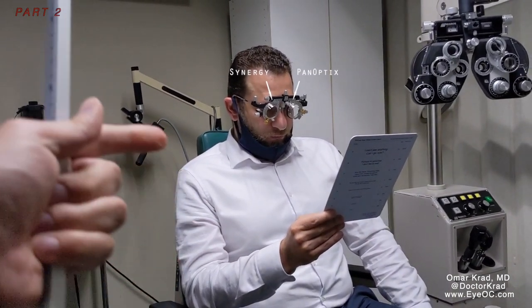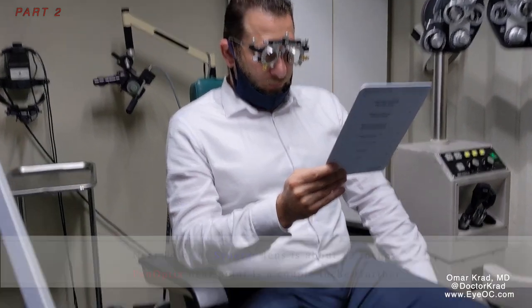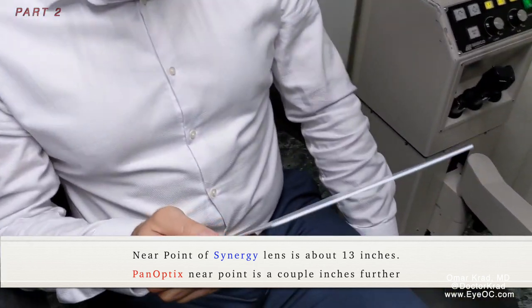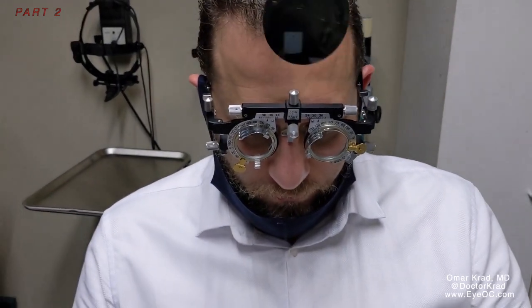This is take two with my patient who has a Synergy in one eye and Panoptix in the other eye. He's distance corrected. We measured this at exactly 13 inches from his eyes, and we're going to compare the reading. He's reading one of the bottom lines, and we'll see which one is better.